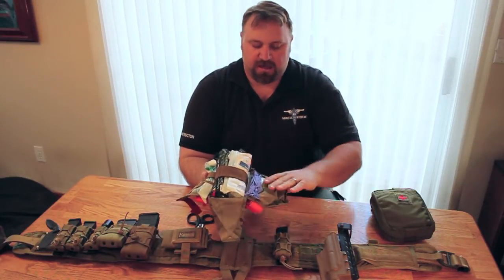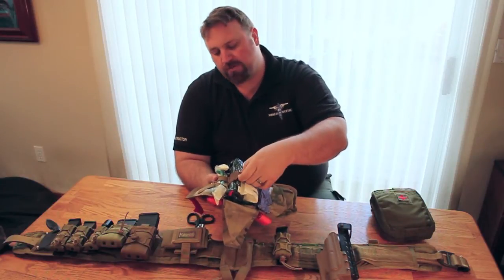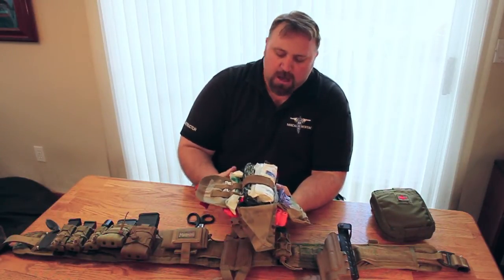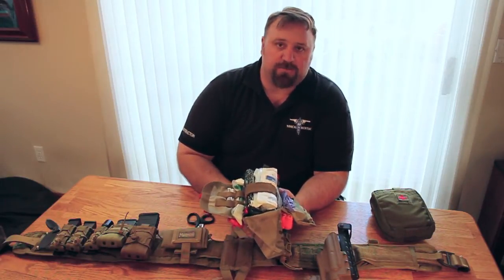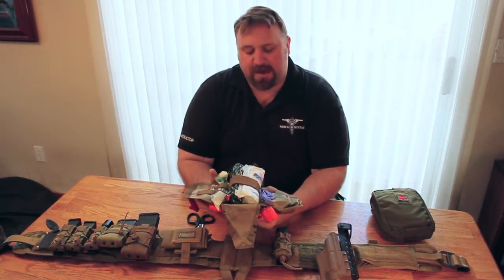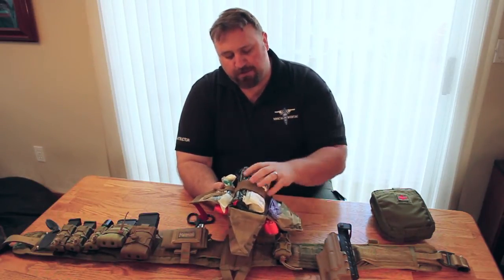On the inside you have one pouch section. The center has a large elastic band with two smaller spots, and the other side has three elastic bands for stowing gear. When you think about what you really need for your individual blowout kit, you're looking for something to stop external hemorrhage, deal with an airway problem, and also deal with a possible tension pneumothorax — those are the three big killers on the battlefield and in trauma in general. That's what you need to pack for.